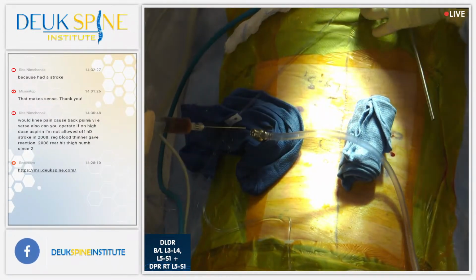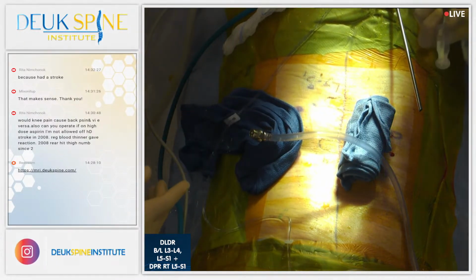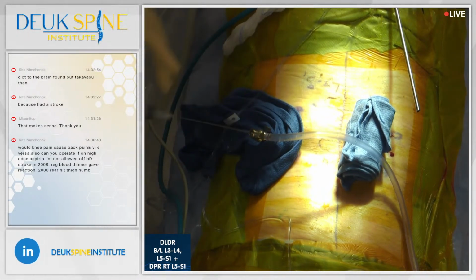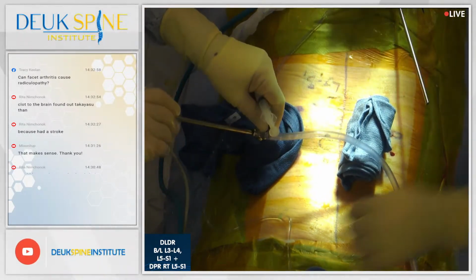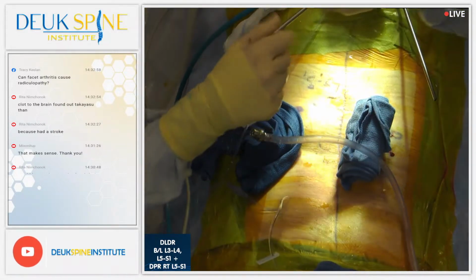All right, did I answer the question all the way? I believe so, yes. Great. Well, we're finished with the discs. Now, remember I told you earlier, he has not just disc pain, he has facet pain as well. So he's decided he wants to get it all fixed, and I think that was the right choice. We're going to fix his facet.